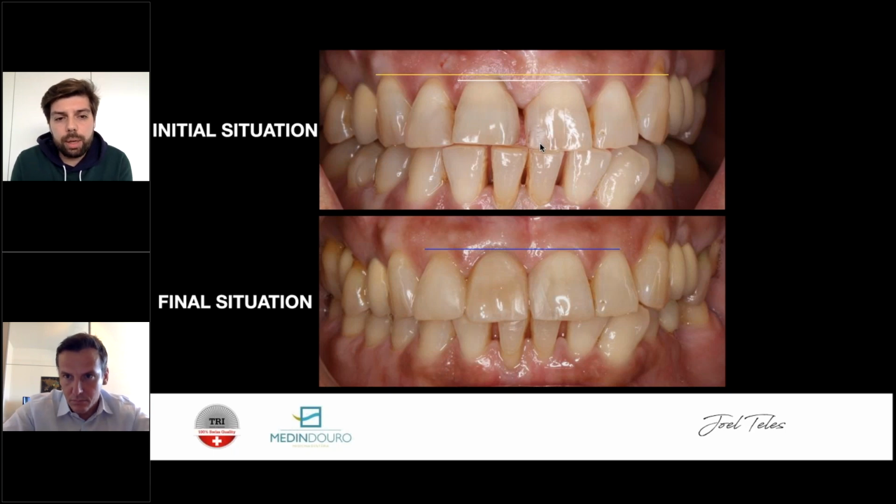And this was the placement day. And you already can see that this looks better, but the biotype still isn't. It's better than at the beginning. You can perfectly see that, but it still isn't as beautiful as you wish. So at this moment, I was considering if I should or shouldn't have done a graft, a tissue graft. This is the X-ray.